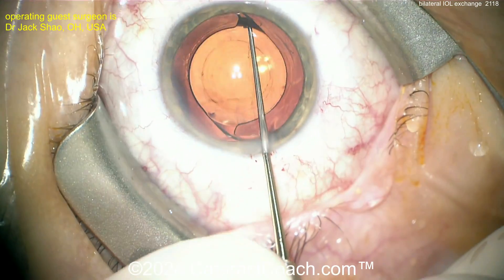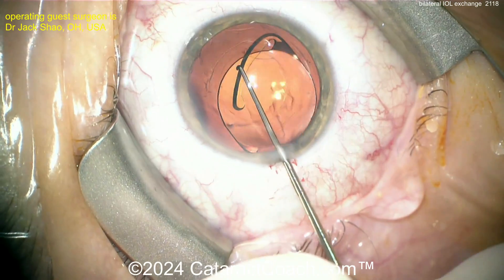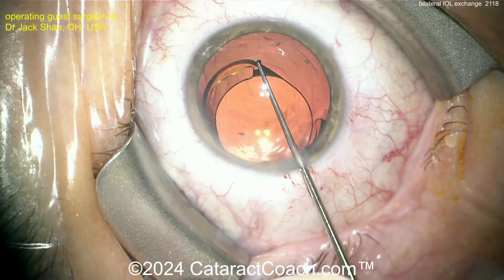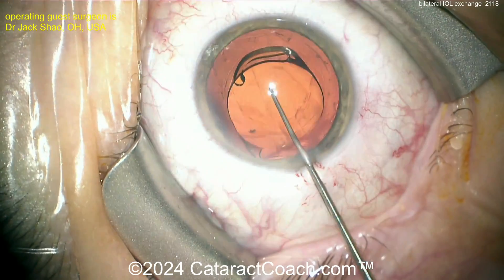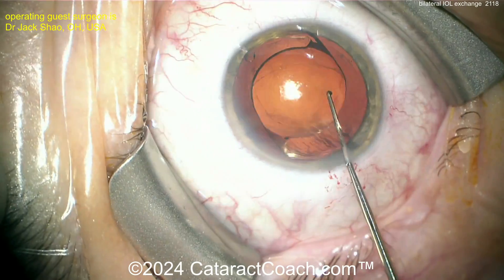You want to open up the capsular bag and separate the anterior and posterior leaflets of the capsule so you can access the lens and bring it up. Going around it — if you get to the adhesions, the bulbous tip of the optic or haptic can stick to the capsule and become encased in there, so don't force it. You may need further visco dissection or even manual dissection.